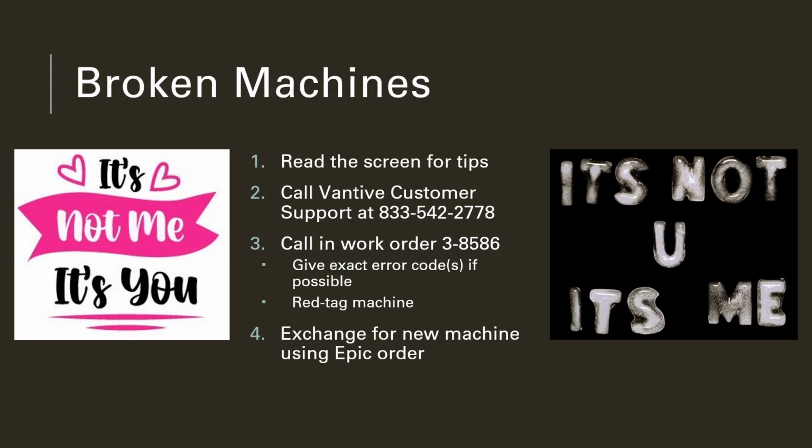One of the things that you guys as eICU nurses are really important for is troubleshooting, and the need for broken machines to be processed correctly is really imperative. The nurses should follow sort of a troubleshooting order of steps. The first one is read the screen for tips. By the time they call you in eICU, this screen may not be available. However, there are informational pieces on the screen that are important.